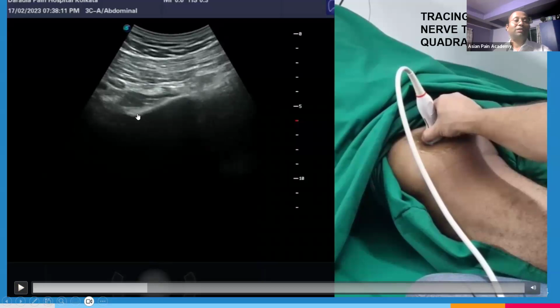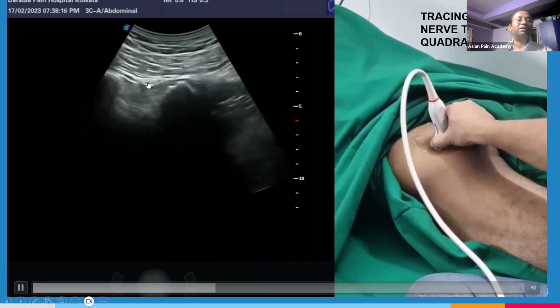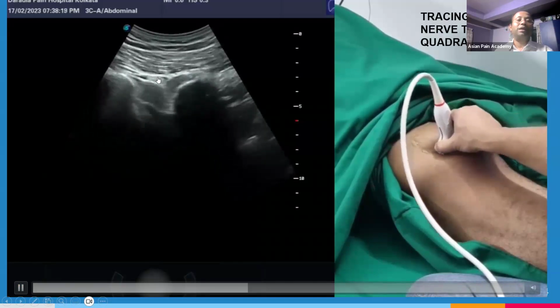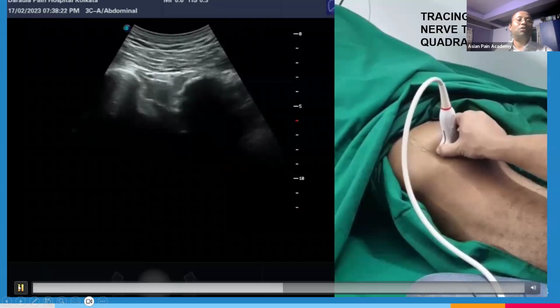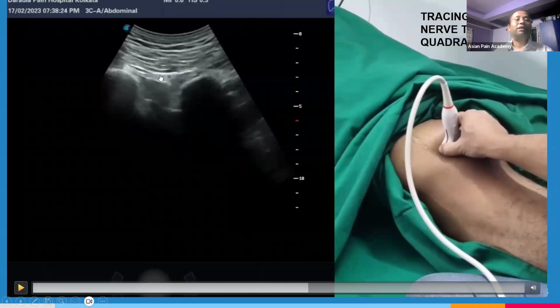It's okay. But above this ischial spine, we see the gemellus superior, inferior and obturator internus muscles here. And also we see that above these muscles, the sciatic nerve comes laterally. Okay. So we'll see how the sciatic nerve comes laterally. So this one is the sciatic nerve. It is coming. It is coming. And now at this point, I think you all know, because it comes in regional anesthesia, we see the sciatic nerve between the gluteus maximus and quadratus femoris here. This is the sciatic nerve. This is the greater trochanter. This is the ischial tuberosity.